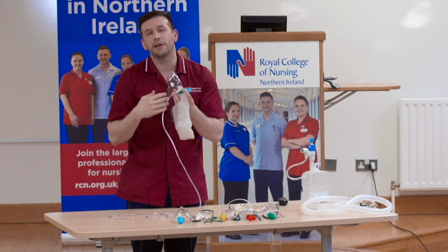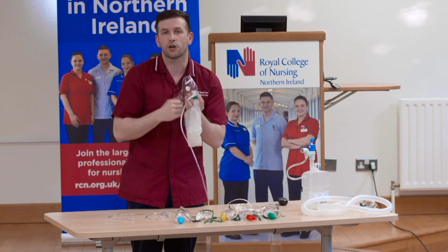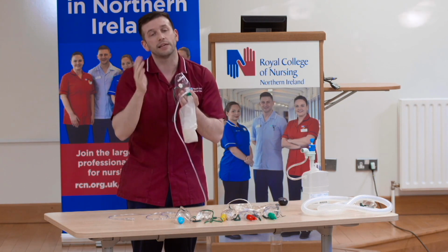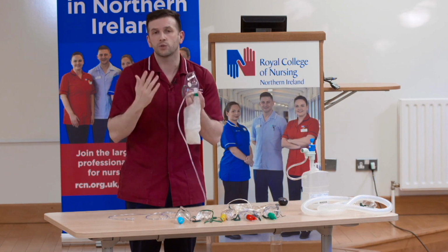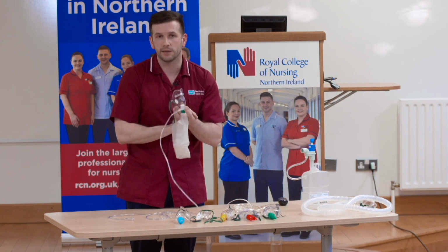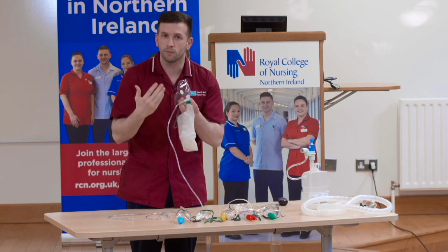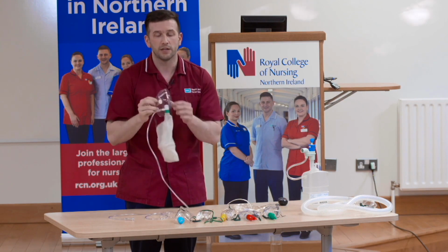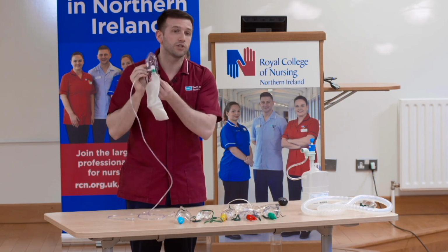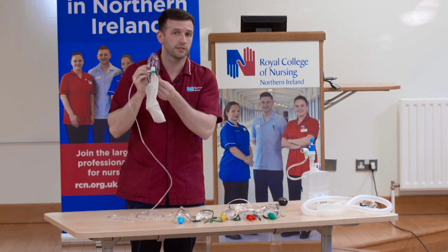There will always be an inevitable room air entrainment into this mask, which can dilute the concentration of the oxygen, giving some inconsistencies in the concentration accuracy, hence why we say between 60 and 90%. Patients' respiratory rate and tidal volumes will also make an impact on the amount of oxygen therapy that they receive. To recap, this is high flow oxygen therapy in the presence of a hypoxemic patient and critical illness.